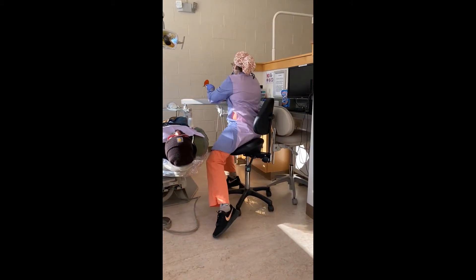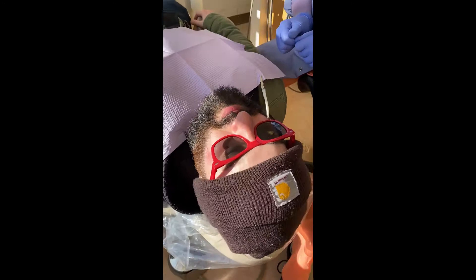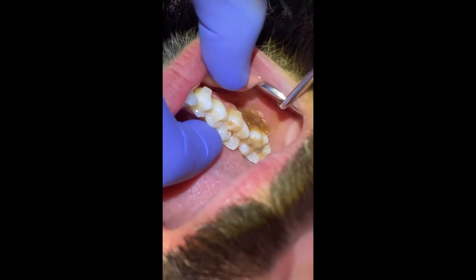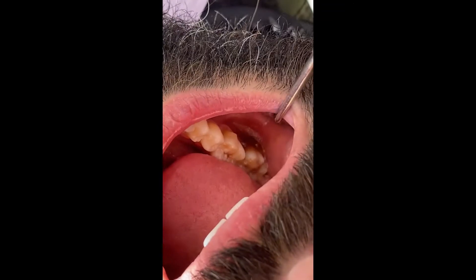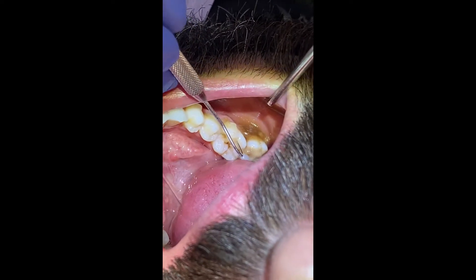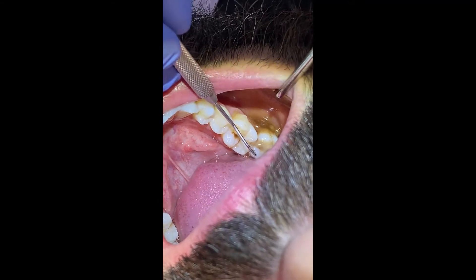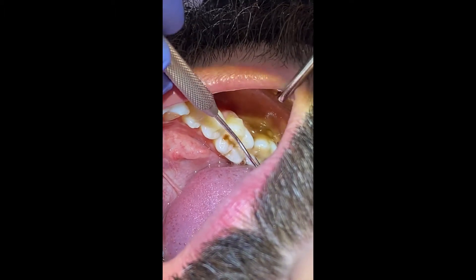We're going to take a quick peek at the occlusal surface of his teeth. We are going to be placing a sealant on number 30. As you can see, the patient has a little bit of debris located in the occlusal grooves, and this is an important reason as to why we do a sealant. When patients get food debris stuck inside the pits and grooves of the teeth and it's left for long periods of time, it's going to start to demineralize and form pit and fissure cavities. If we can prevent these pit and fissure cavities, hopefully we can lower the incidence of cavitation in the mouth.